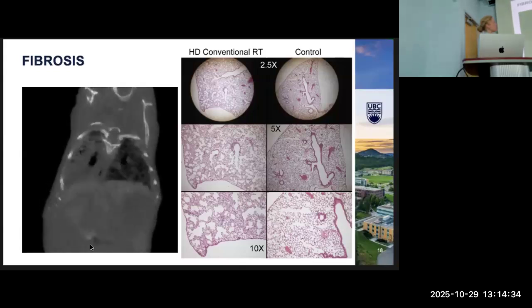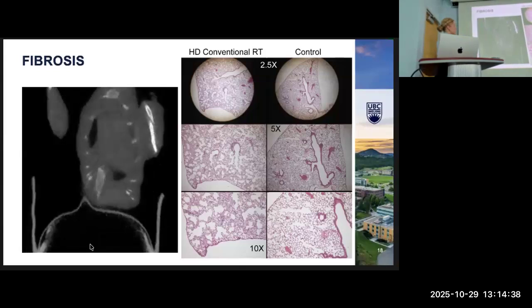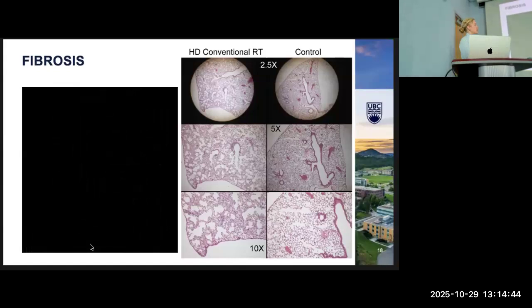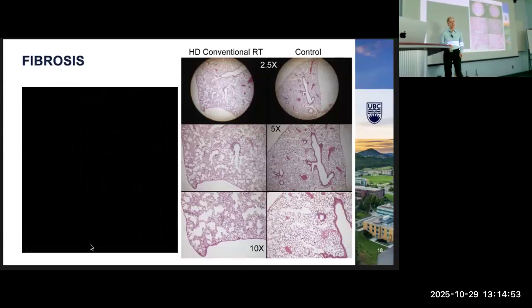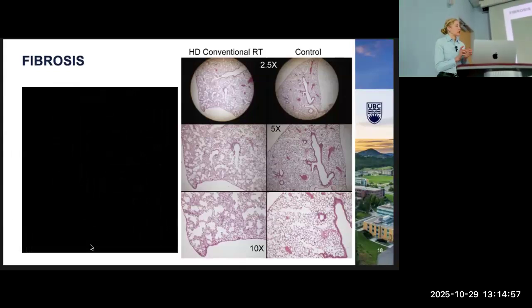And then we looked at histology as well. The center column is our same mouse as in this video, and then on the far side is a control mouse. It's hard to see from a distance, but we have 3 different magnifications. You can see the control one is a lot more uniform looking. We have nice little round alveoli fully enclosed in tissue, which is the part that's marked in red.